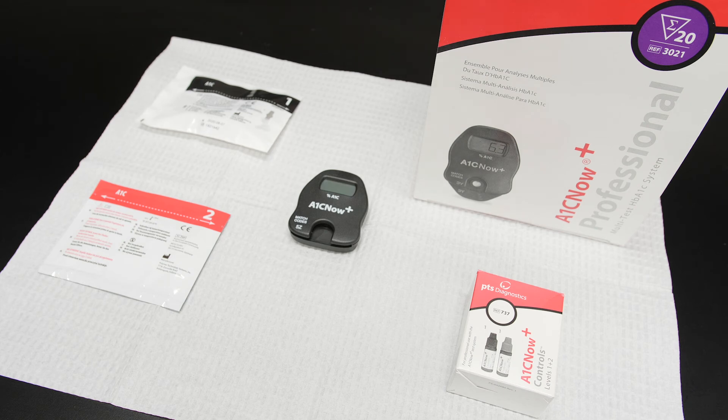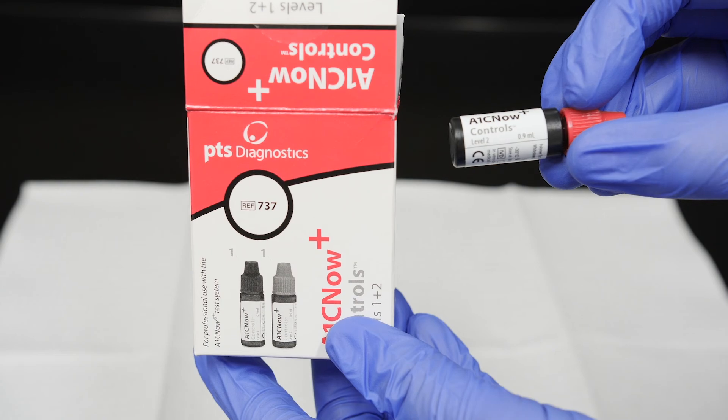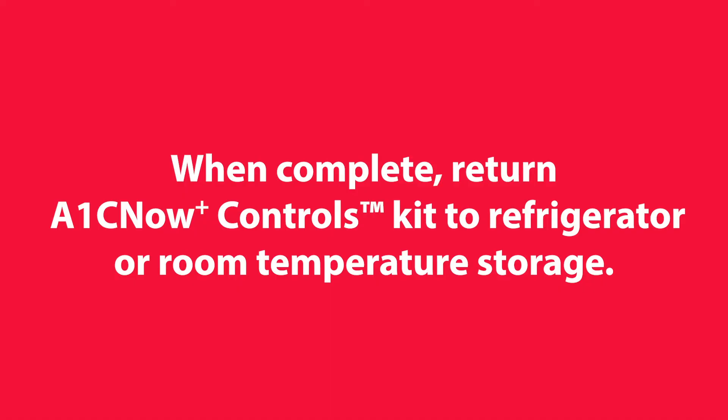Using new shaker and cartridge pouches, repeat the procedure using the Level 2 vial of control solution. When complete, return the A1C Now Plus Controls Kit to the refrigerator or room temperature storage.